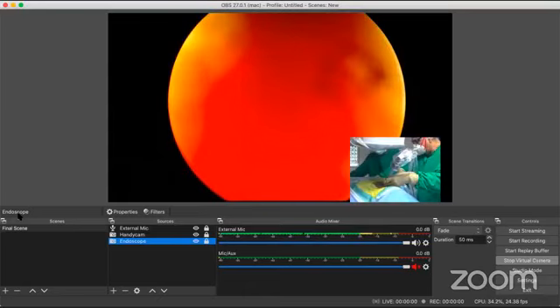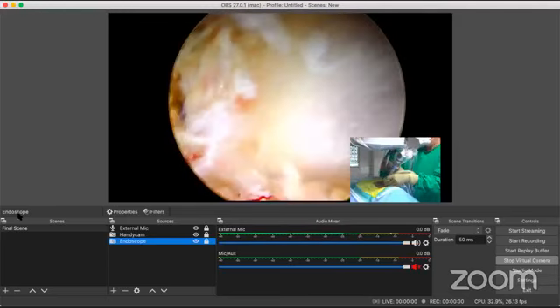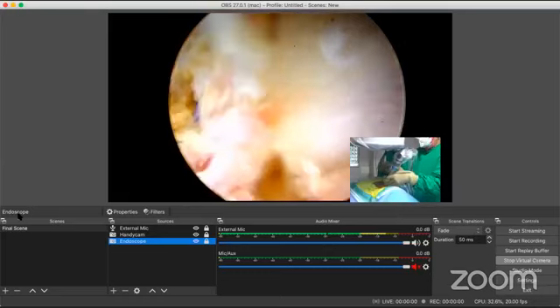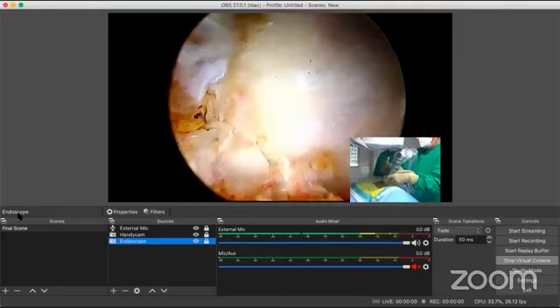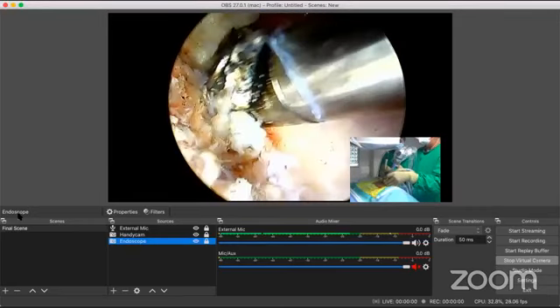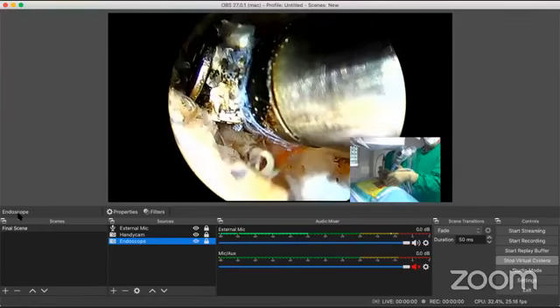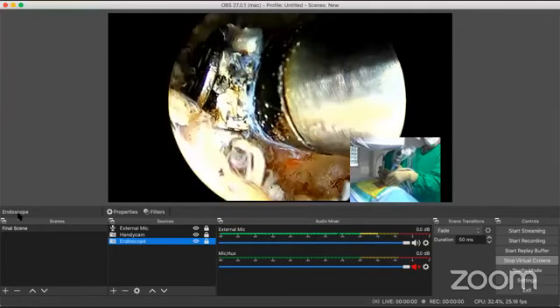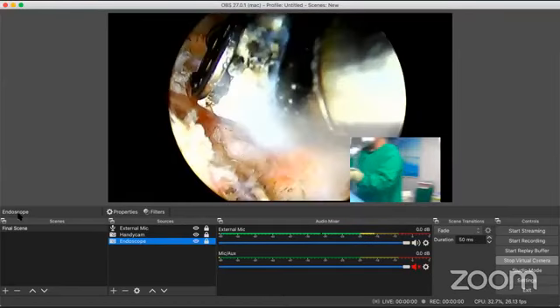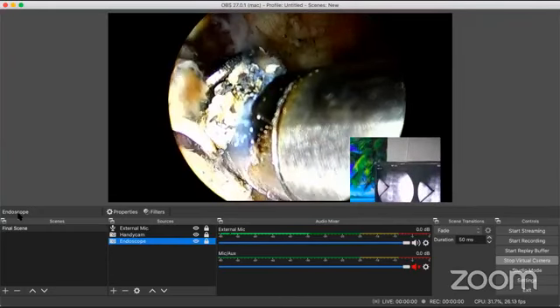Dragging on me, man. Thank you. Yeah, now I'm comfortable. Cervical spine is a bit of a headache because you need to keep the head up. One minute, please, before you take it back. Yeah, take one more shoot, please. Now push the machine a little in front and shoot. And now you'll see that both my instruments will be on the upper lamina. See, both my instruments on the upper lamina. She'll show you. Yeah, both the instruments. Focus, please, zoom there.